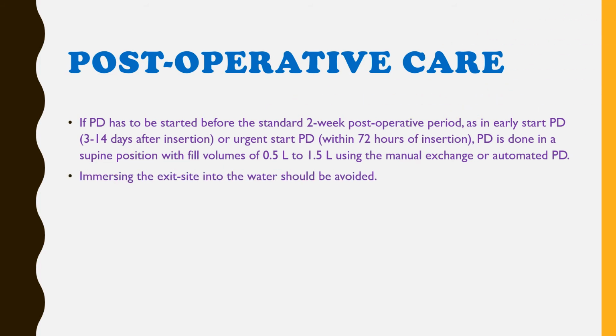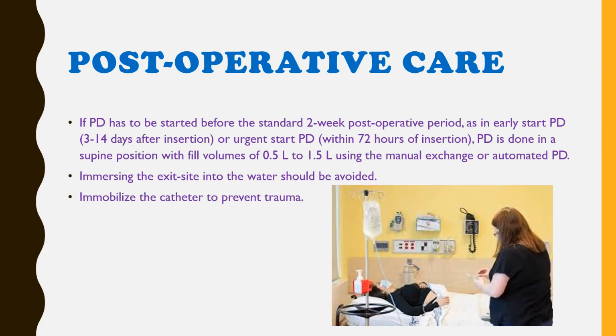Immersing the exit site into the water should be avoided. Immobilize the catheter to prevent trauma.